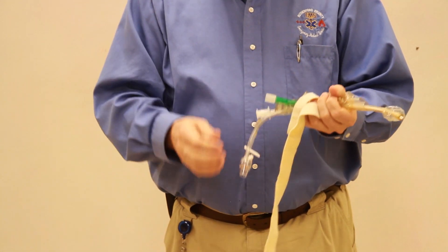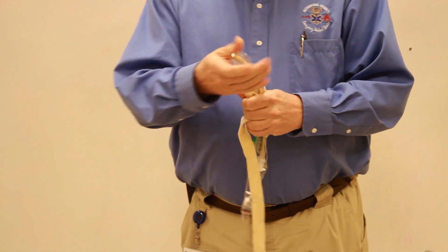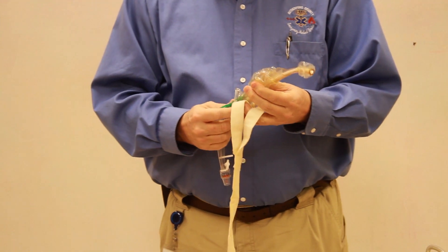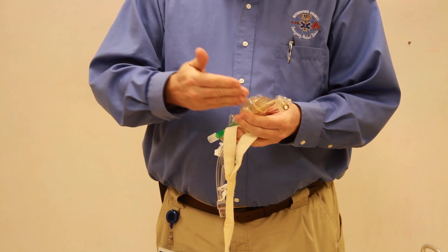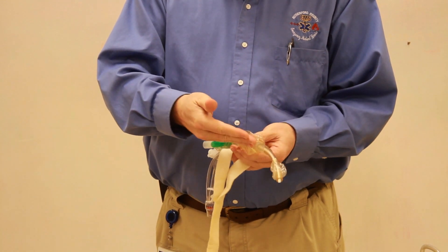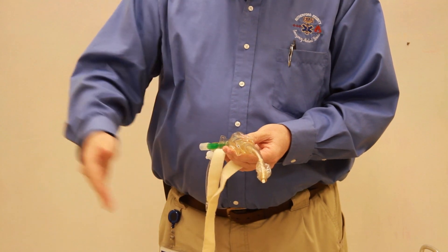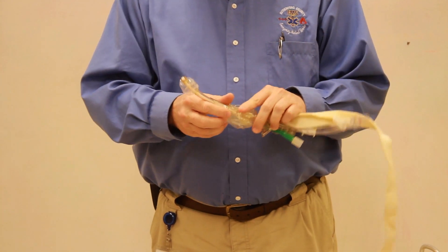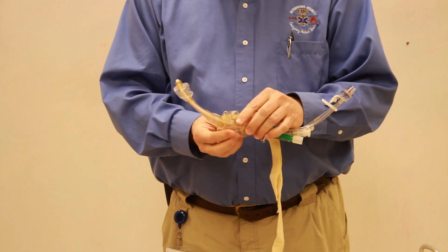Remember the indications and contraindications for this airway — you'll need to study those in your book. With this airway, we do not want to check it before we put it in, because it is folded in a particular way. When we insert it, we want it to stay in that same fold so the airway is guaranteed.